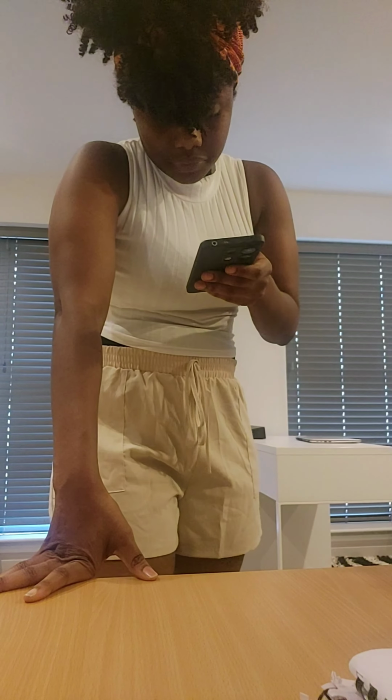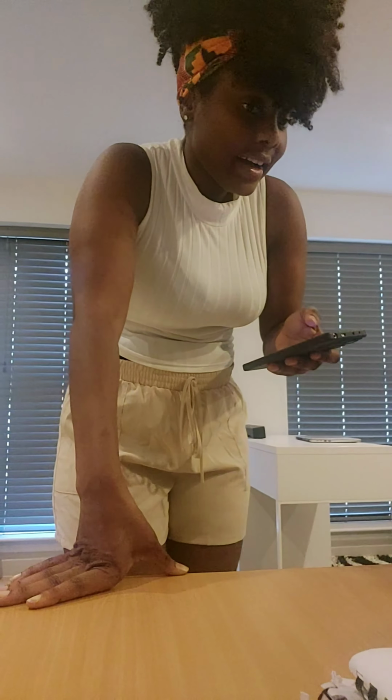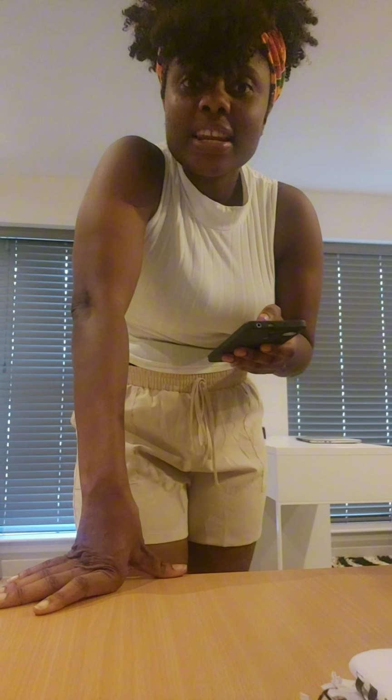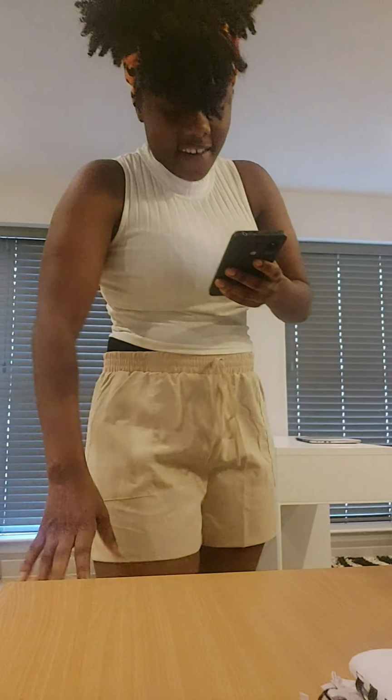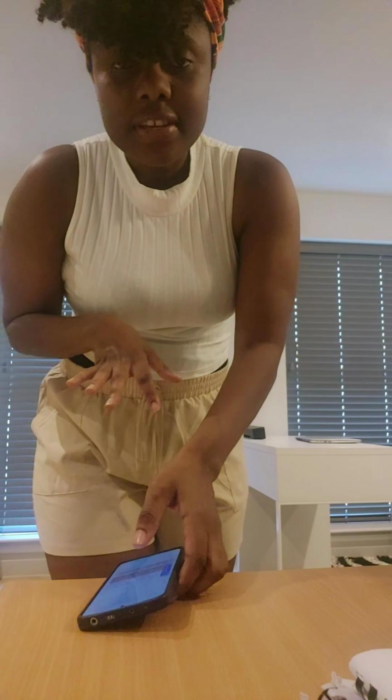Annie, as I said earlier, I'm here to check your IV cannula site for any possible signs of infection. If there's any infection, I'll escalate to the doctor, and I will also flush your cannula to check the patency of it. Are you okay with that? Are you happy for me to do it? Yes. All right. So, Annie, I'm going to prepare the equipment that I'll be using for the procedure. I'm just close by. If you need me, kindly call my name, okay? I'll perform my hand hygiene again and leave the patient bedside.